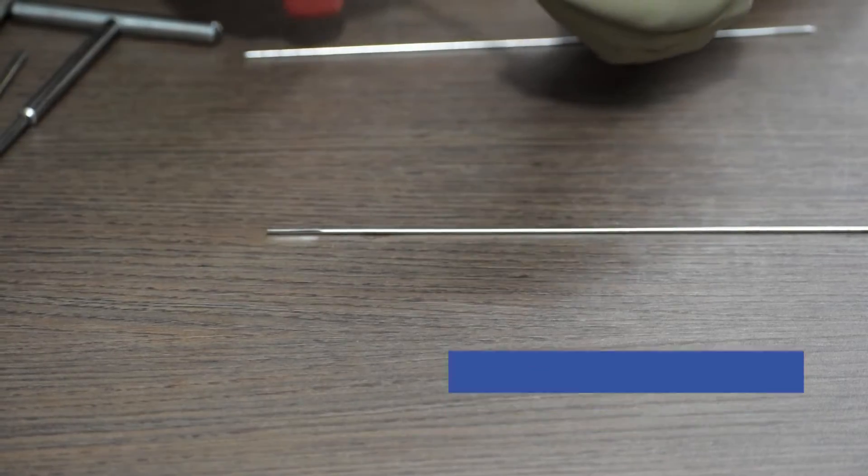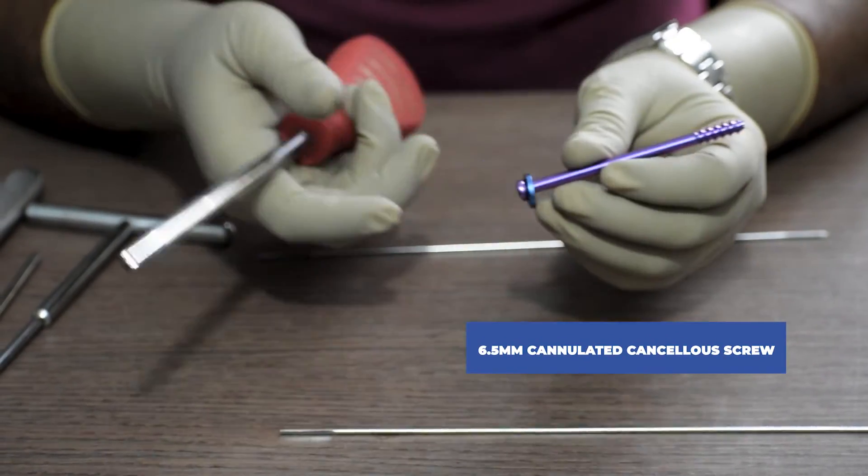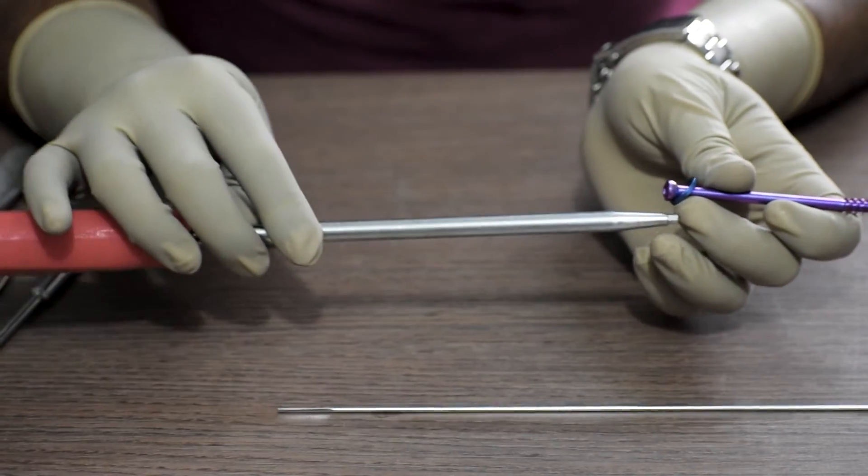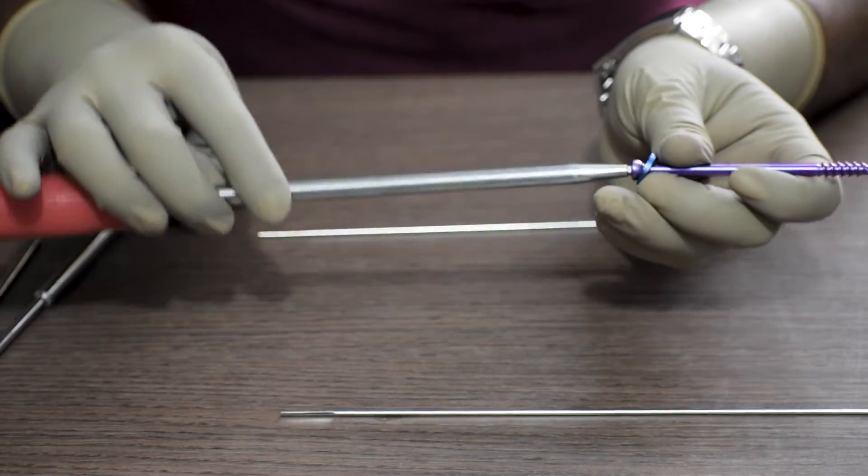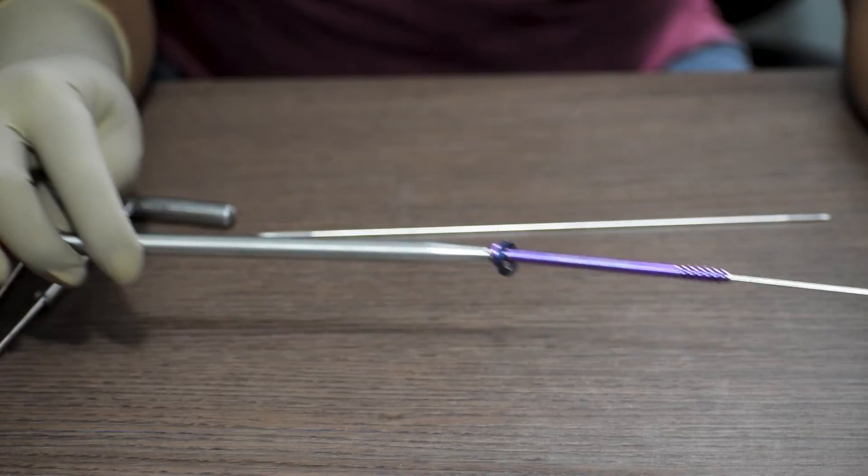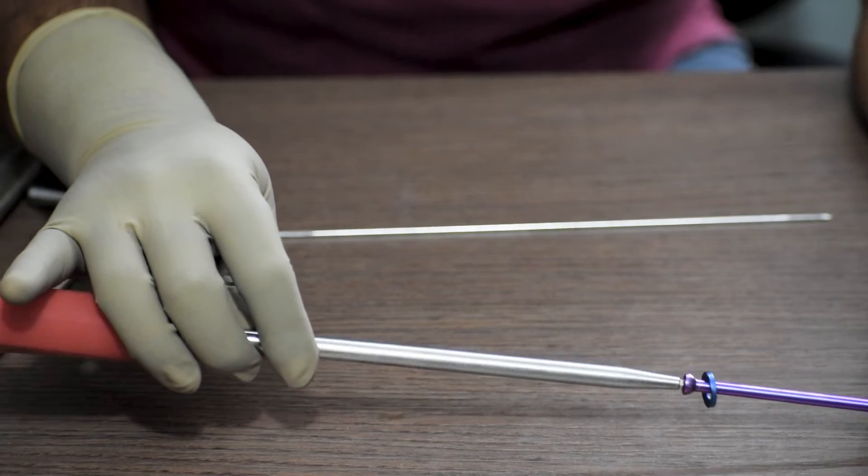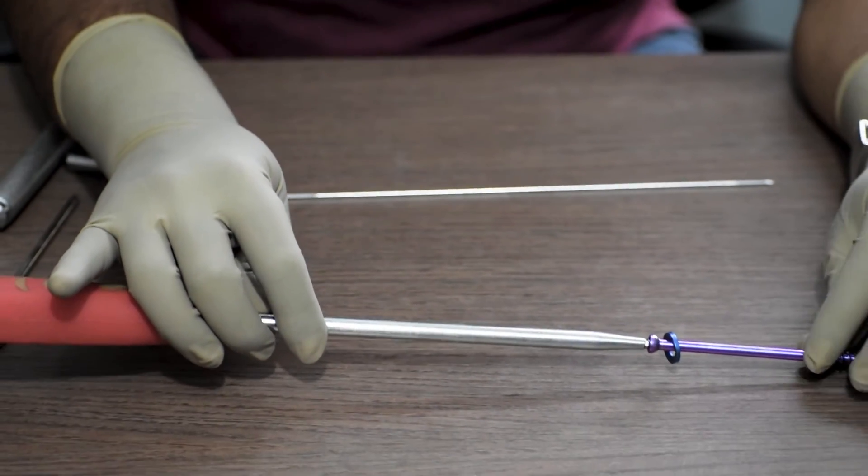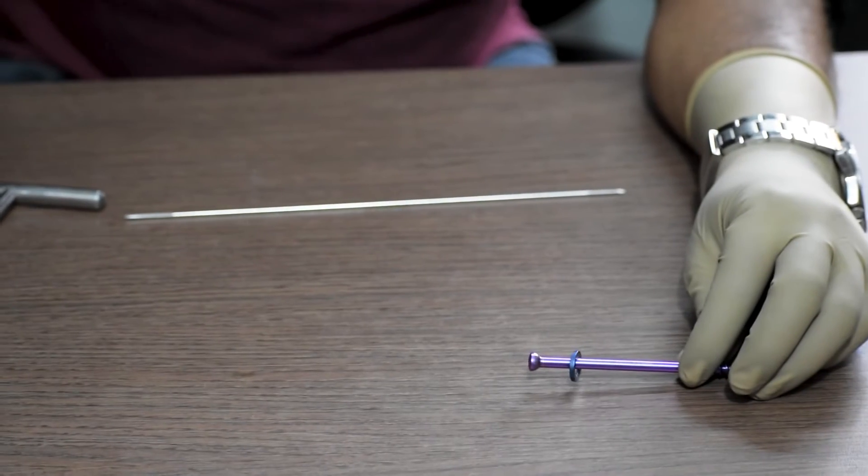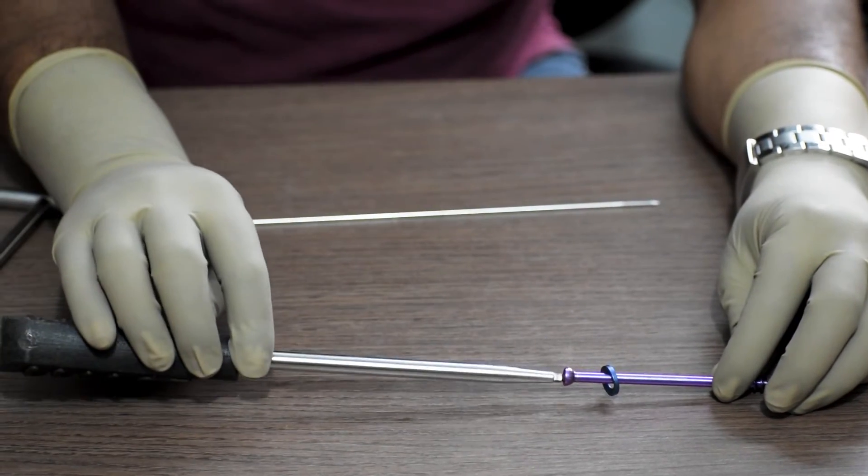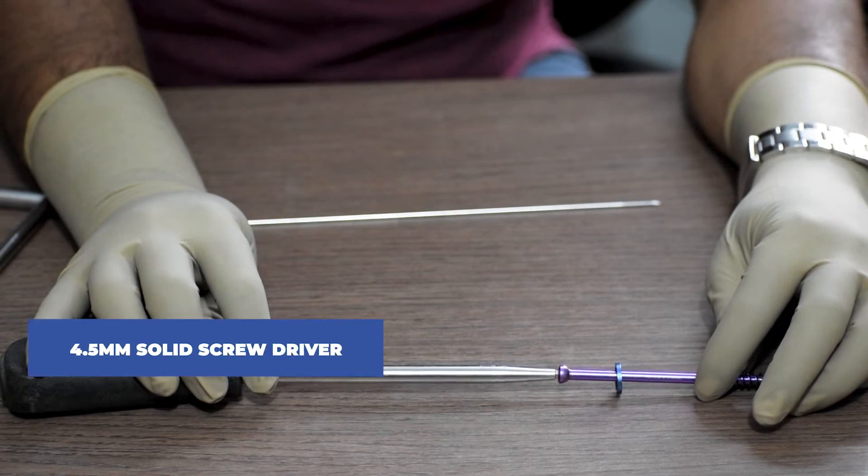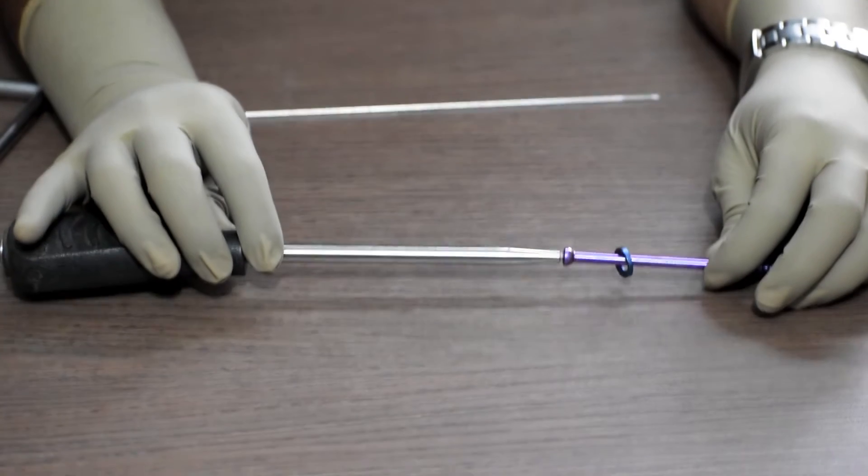Once the tapping is done, we will take a 6.5mm cannulated cancellous screw with washer of the measured length. And with the help of a 4.5mm cannulated screwdriver, we are going to fix the screw. Thereafter, we will take out the cannulated screwdriver and the guide wire while the 6.5mm cannulated cancellous screw stays back. We will use a 4.5mm solid screwdriver in order to give the final tightening to the screw.